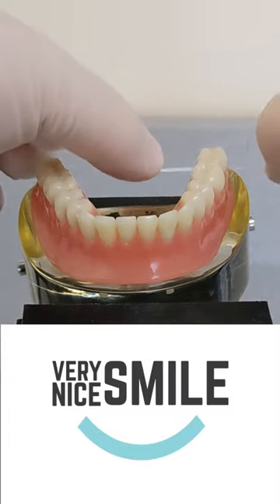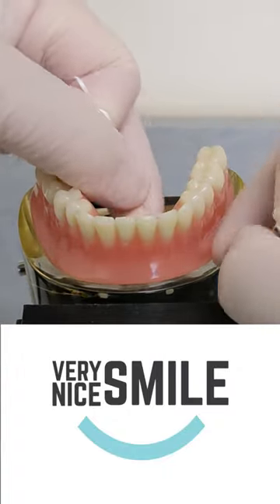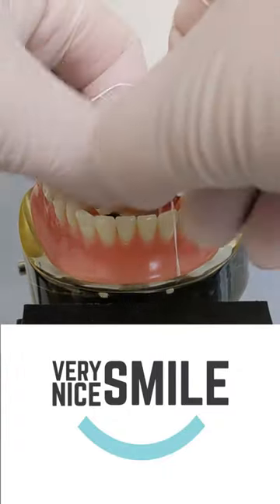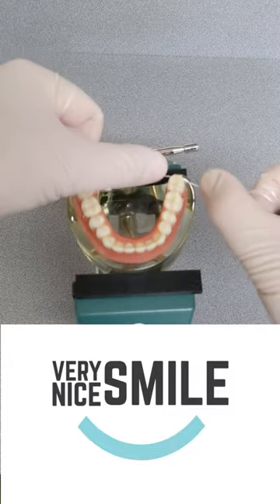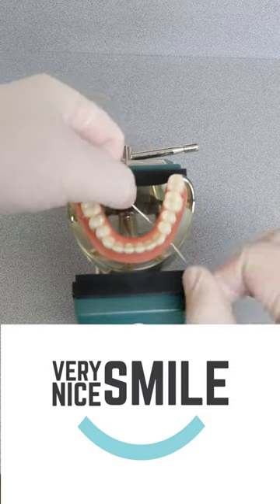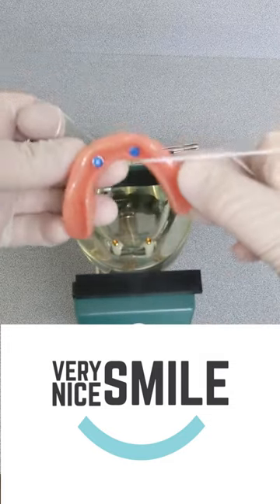Let me show you again on the other side. Slide it under the end of the denture and up against the snap, then pull up. Here's another view so you can see what I'm doing. Slide the loop under the end of the denture, then forward to the snap, then pull.